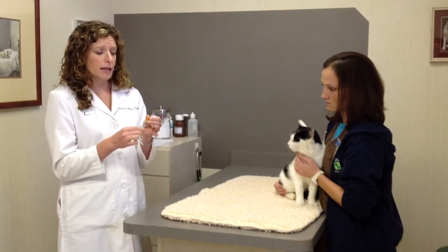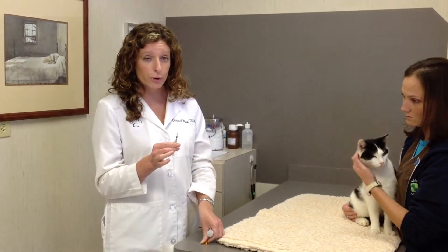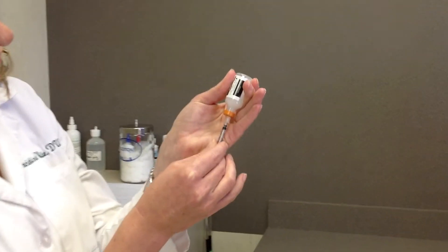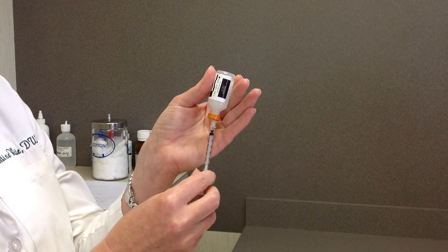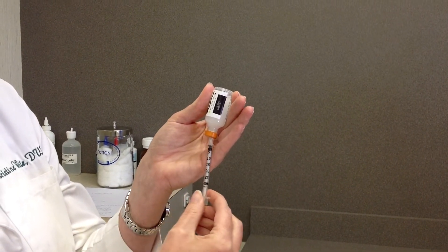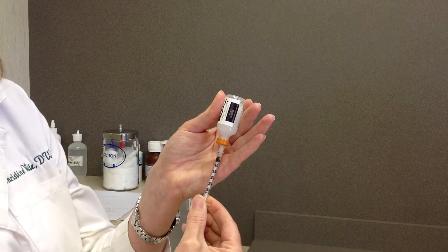Now, your veterinarian will let you know what dose of insulin you need to give your pet. For Wiley, we're going to draw up three units. I'm going to insert the needle into the bottle. There's a little bit of air in the syringe, so I'm going to depress the plunger to inject that little bit of air into the bottle. Now I will draw down one, two, three units of insulin.